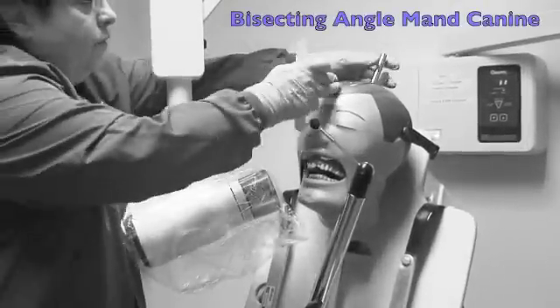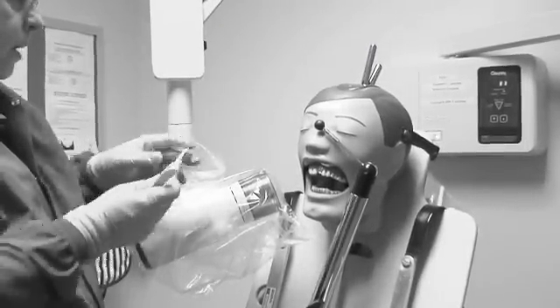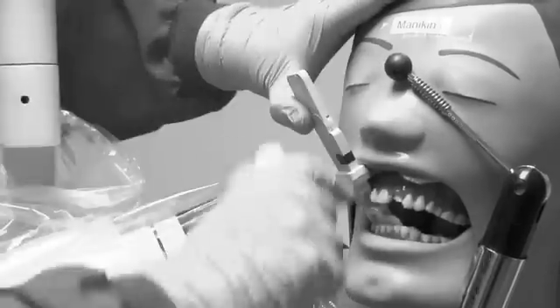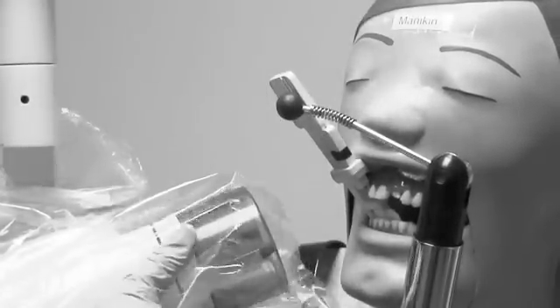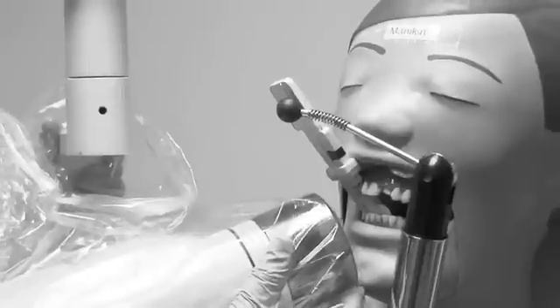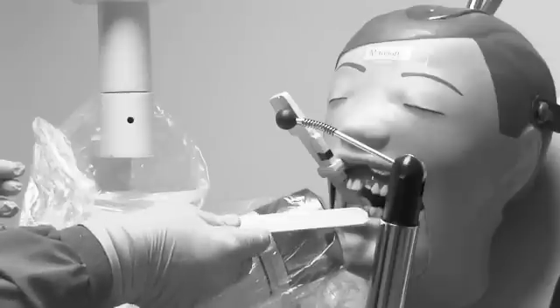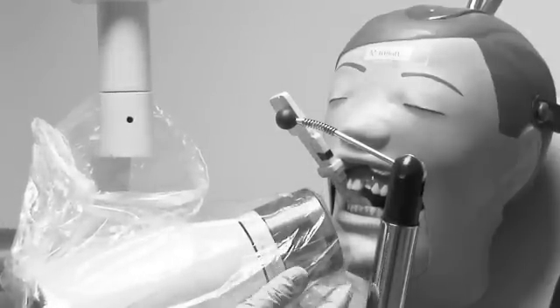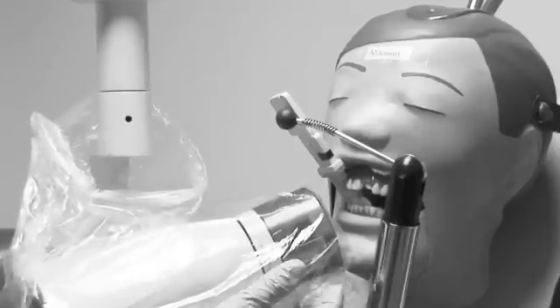For the mandibular canine view, we can leave our angulation at 15 to 20. Place it against the tooth, creating the border by leaving a little space above the teeth. To get the full film, stick the border of the mandible — just the chin — right into the PID and then aim at the canine. Check to be sure that the PID is covering the film, and check that the bottom of the PID is right underneath or right behind the chin. Then you will not cone cut.